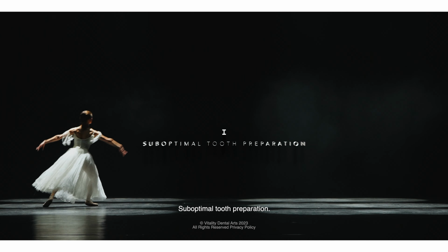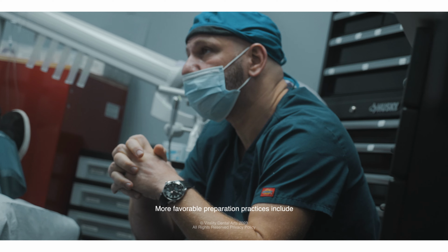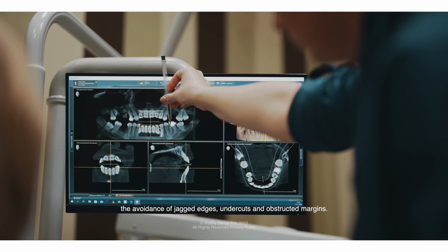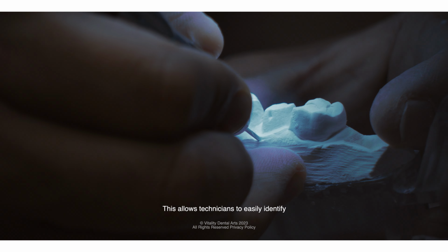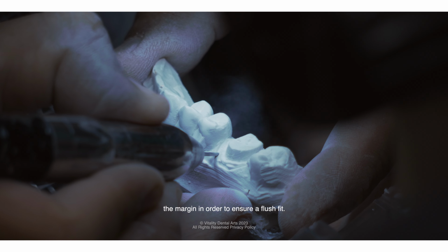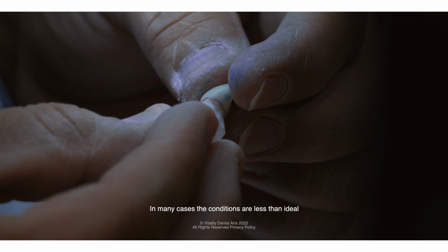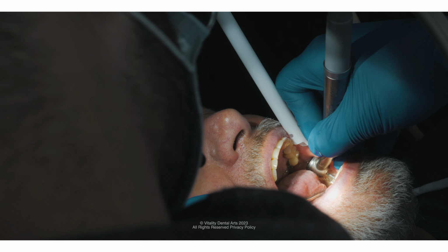1. Suboptimal tooth preparation. More favorable preparation practices include the avoidance of jagged edges, undercuts, and obstructed margins. This allows technicians to easily identify the margin in order to ensure a flush fit. In many cases, the conditions are less than ideal when prepping a tooth, making this an extremely critical step.